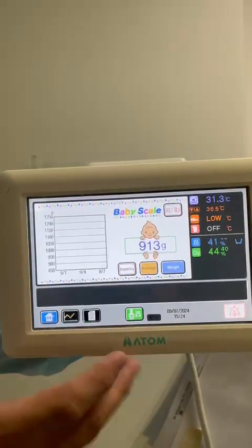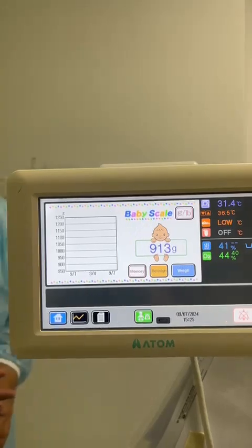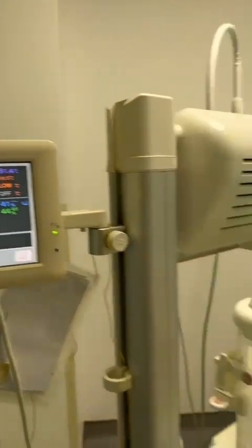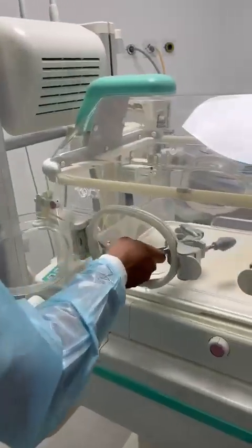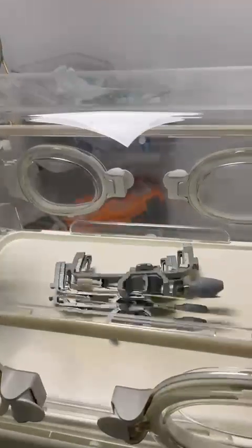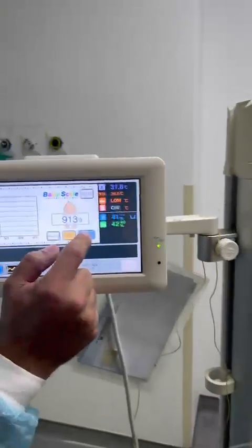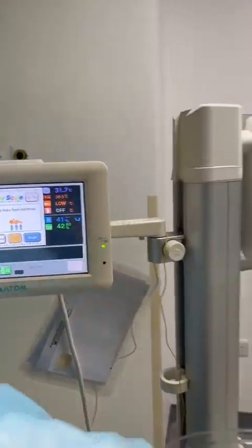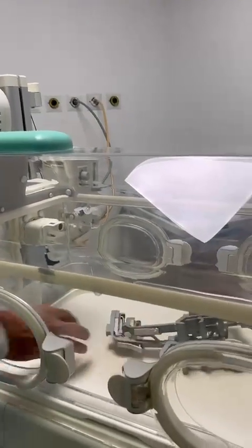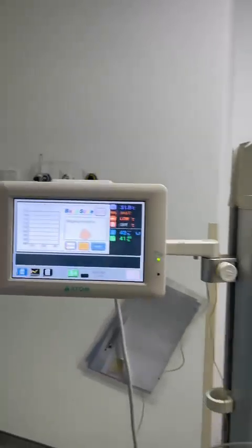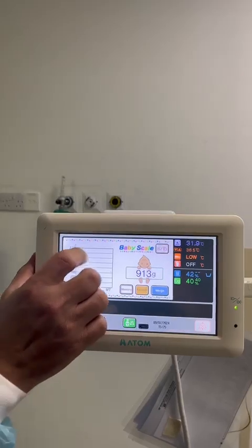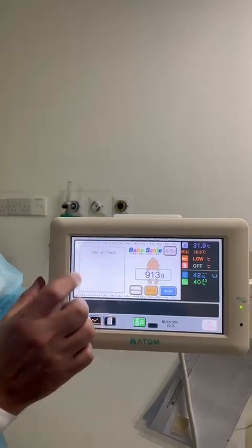For the weighing scale, it is very simple. We can measure from 300 up to 7,000 grams — that is the total capacity. To use it, press and wait, then lift up the mattress and press on the mattress. You can save memory so you can have the graph after a few days, or if not a graph, you can have the data in digit form as well.